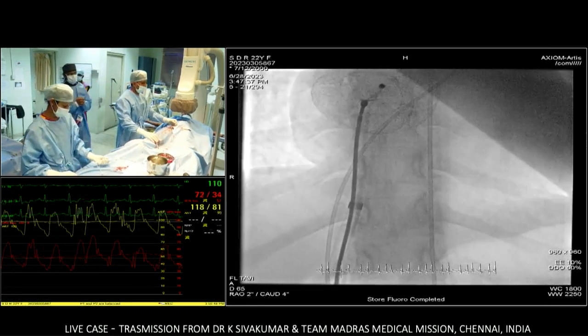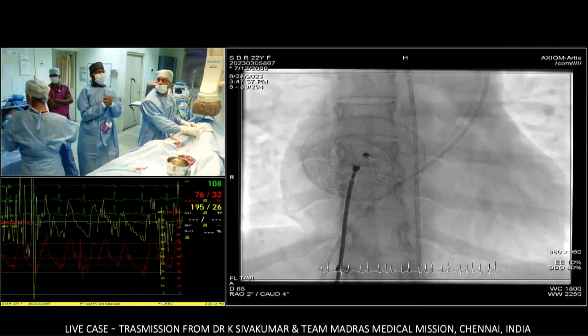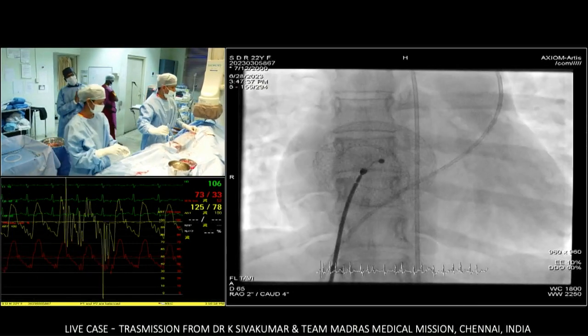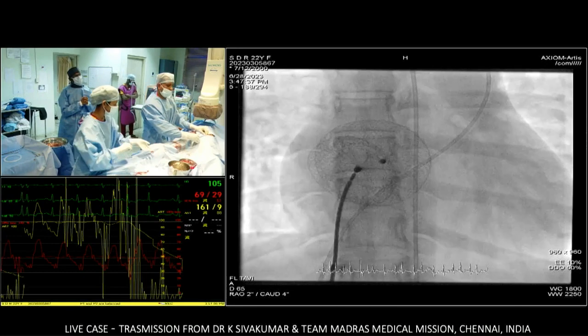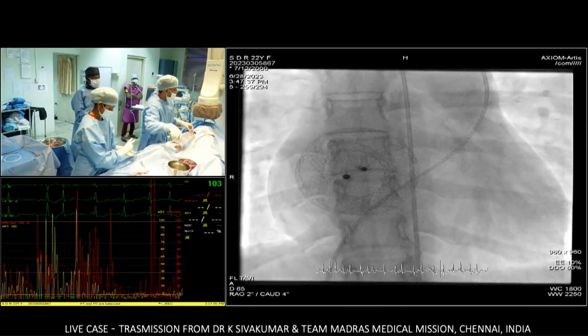What you would have chosen, Eric? In fact, half of the people decided to choose a complete device, whereas we decided for a fenestration. And what you would have chosen? Probably a 32 or a 30. I was looking at a 30 or 32, if you had them available.